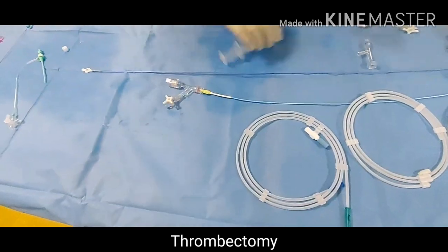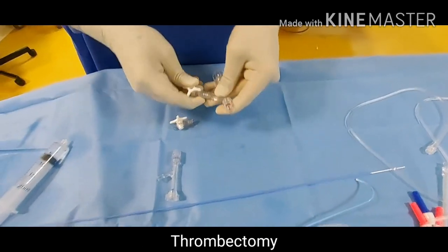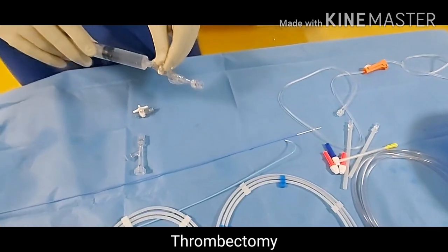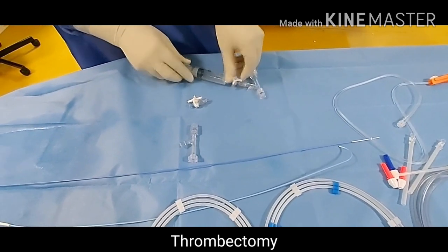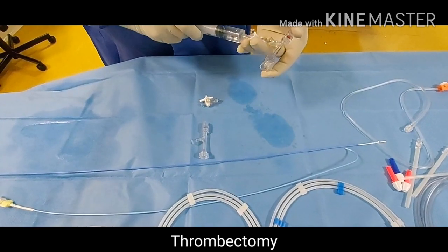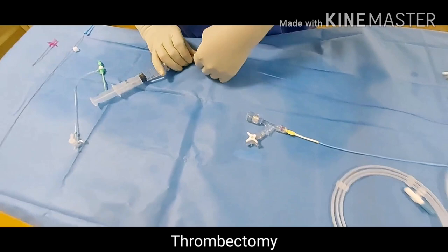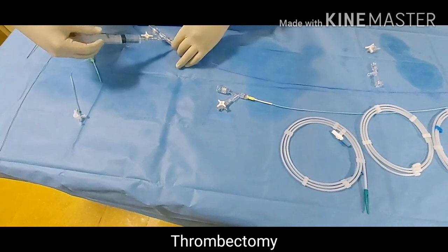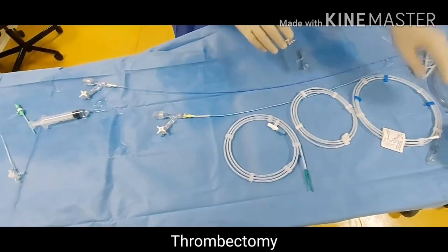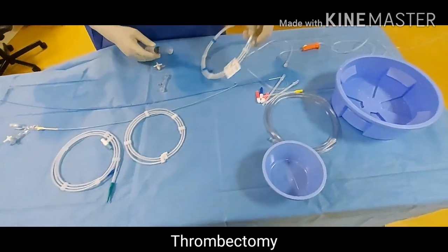Remove this one. Same goes with the sofia catheter — just flush it. Now it is ready. Now we will prepare our micro catheter. For the micro catheter we will use different micro catheters which will fit inside.